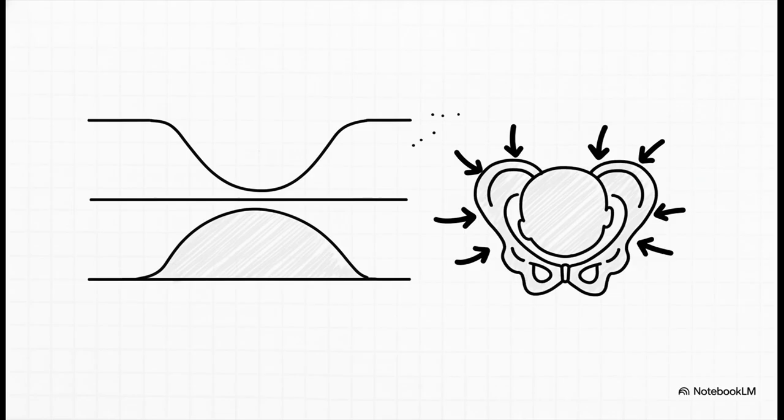So why does this happen? Well, the baby's head is in the birth canal. The contraction temporarily squeezes the head, which then compresses the baby's vagus nerve. That little nerve compression causes a totally harmless dip in the heart rate that bounces back nicely as soon as the contraction eases up. So just continue to monitor and document it, no action required at all.